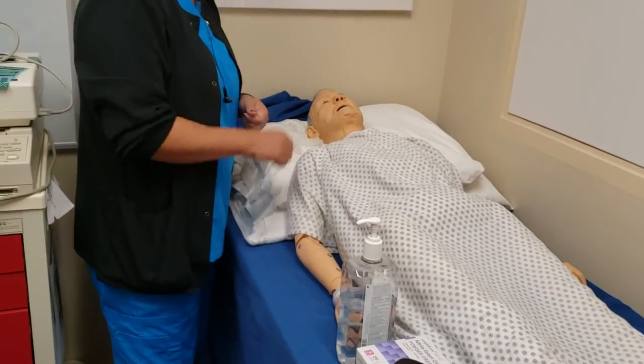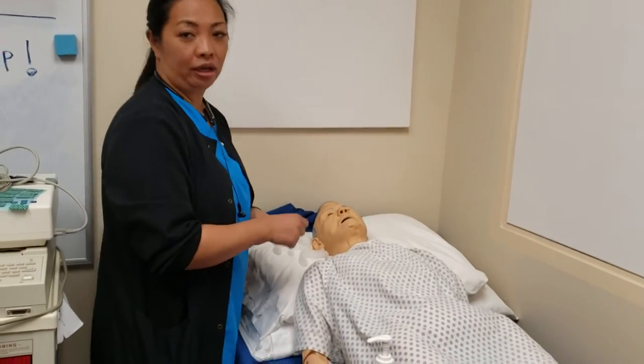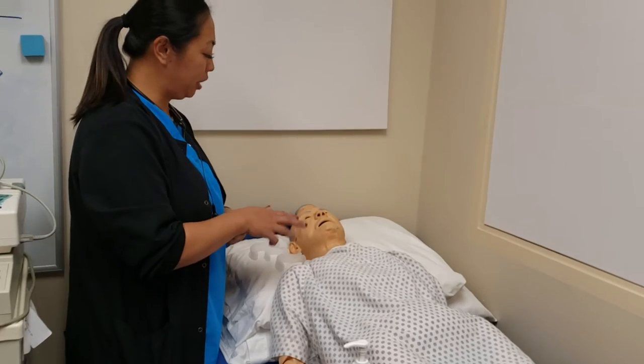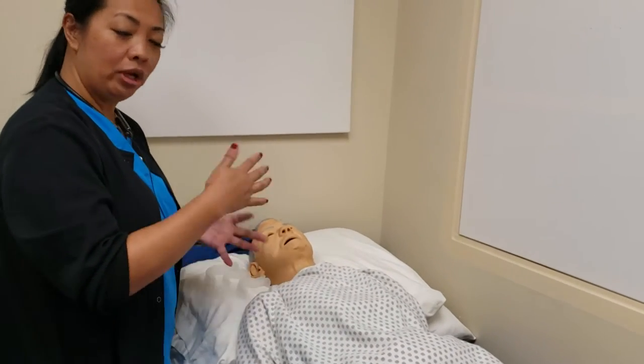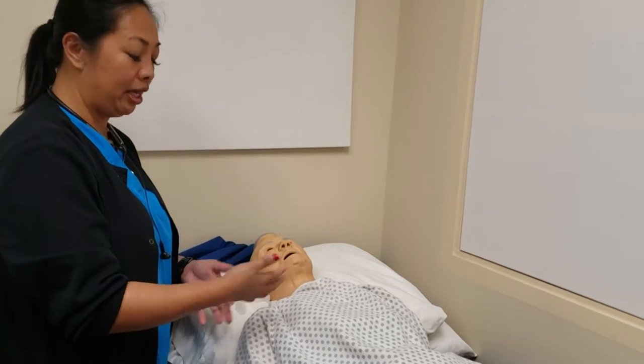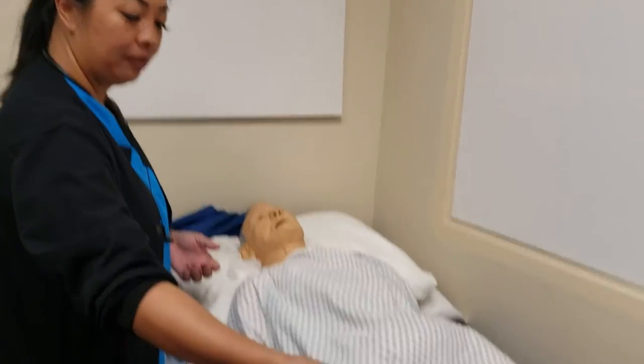For the OPA, or oropharyngeal airway, these are the things you want to put in when the patient is unconscious. You don't want to put it in a somewhat conscious patient or somebody who might wake up, because they're going to end up throwing up.